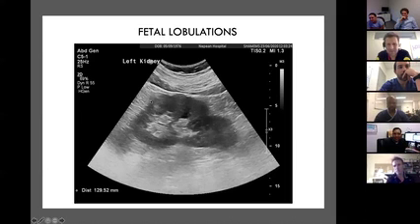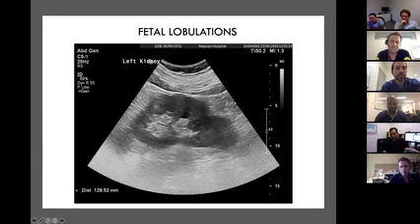You can have some fetal lobulations, very, very common in kidneys because they've been embryologically formed like lobules. They're all trying to come together. It's very common. Don't mistake that as a tumor. It still retains the normal cortical structures, but it's quite lobulated.